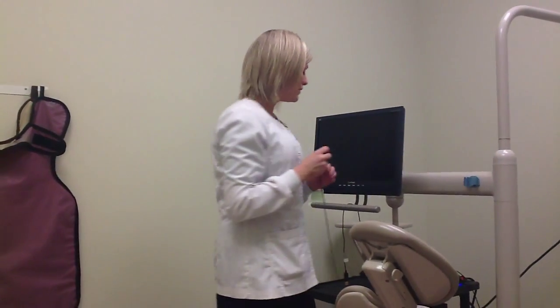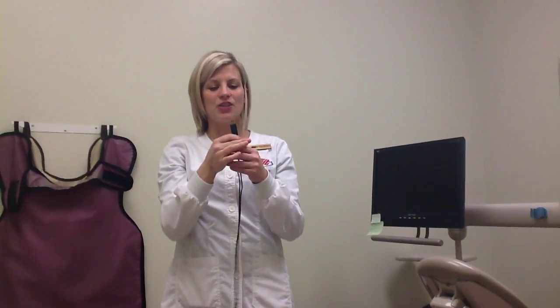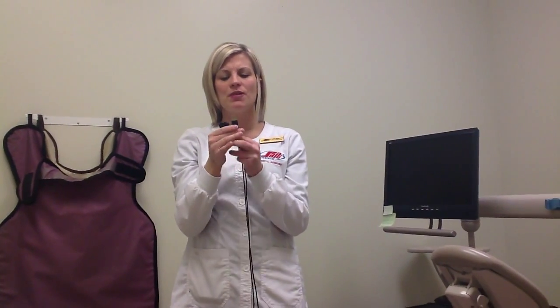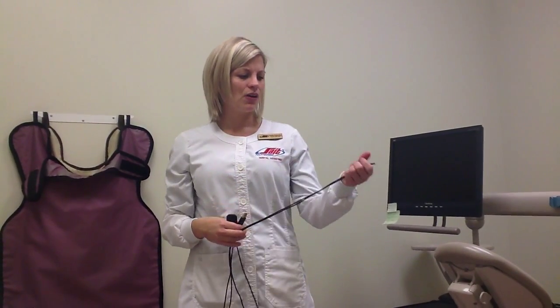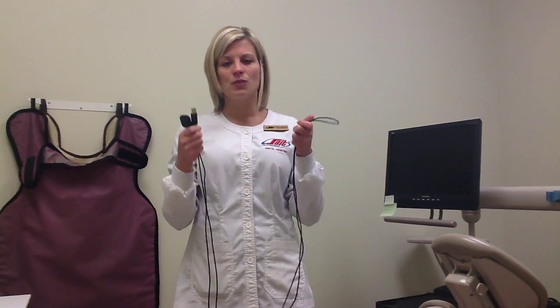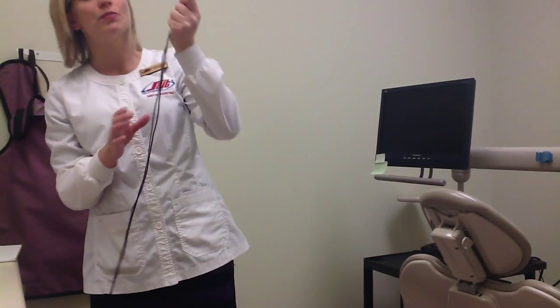Moving on, we're going to talk about care and maintenance. We want to be very careful when using our digital sensors — they're very fragile, and we want to keep them as safe as possible. If we compromise the integrity of our sensor, it will not produce quality radiograph images, which will affect our patients. When transporting these sensors, we want to hold them with both hands — the USB connector and sensor head in one hand, and the rest of the cord in the other. We want to avoid just holding it loosely where it could get caught on things and ripped out of our hands.